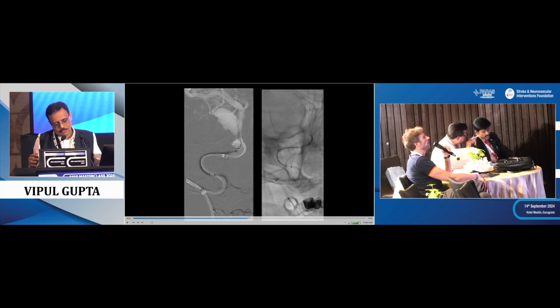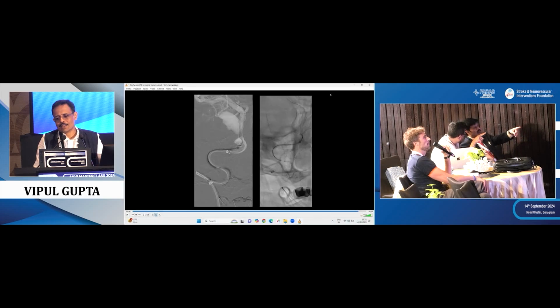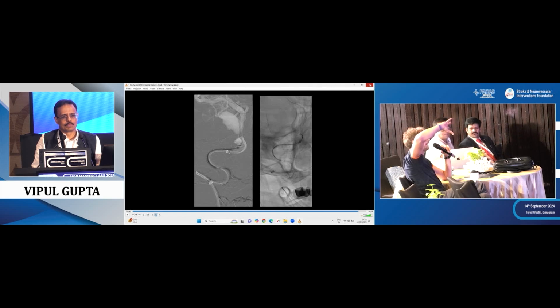Or you can do it 20 times. It will be the same. I did it in vitro as well. It's exactly the same. So the only way, what you did, is that if the stent is not that much attached, when you plasty it, you will force the braid to untwist by plastying it. Yes. That's what you did.